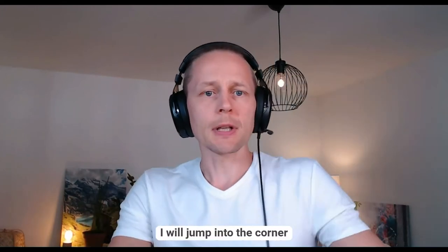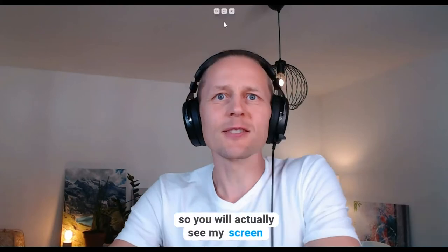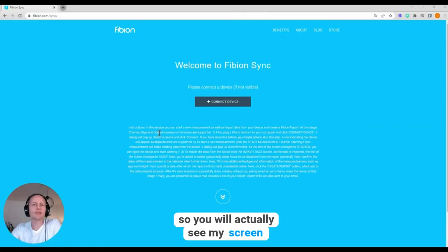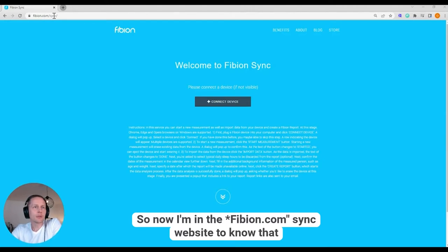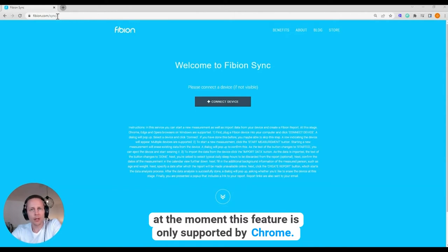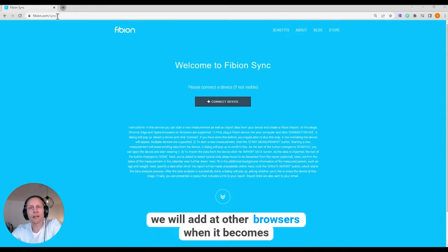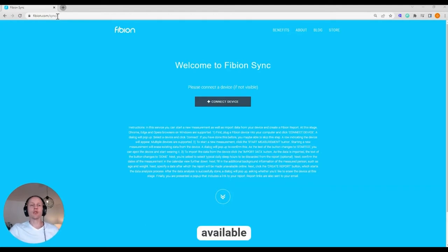I will jump into the corner so you will actually see my screen. So, now I'm in the Fibion.com Sync website. Note that at the moment this feature is only supported by Chrome. We will add other browsers when it becomes available.